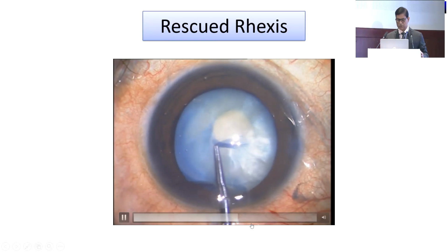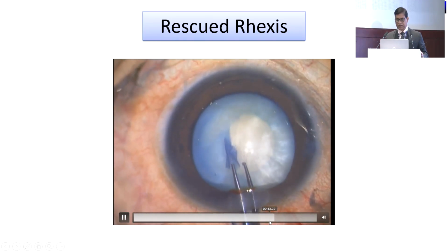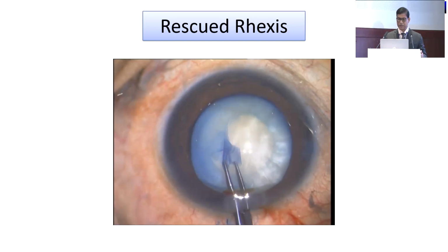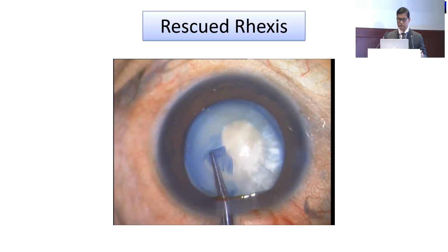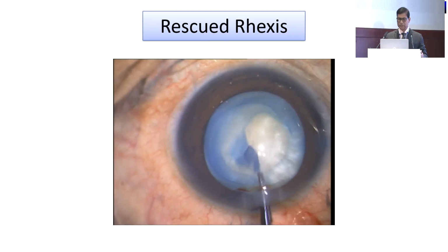Yeah, so this was where I was going fine, and somewhere towards the end here, again I'm going to struggle a little bit. It's going to run, and this intumescent cataract can be there. It is going to now run. There. It started running, so I now give it a tug. I just change the direction, and there it is.